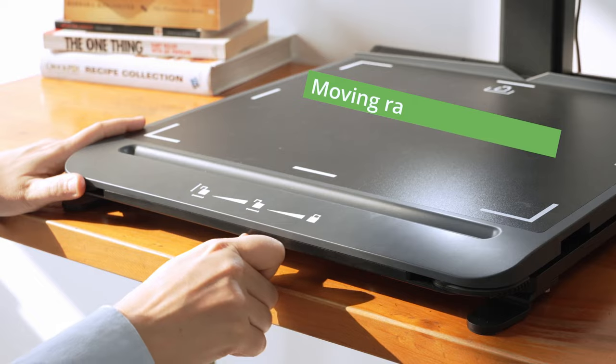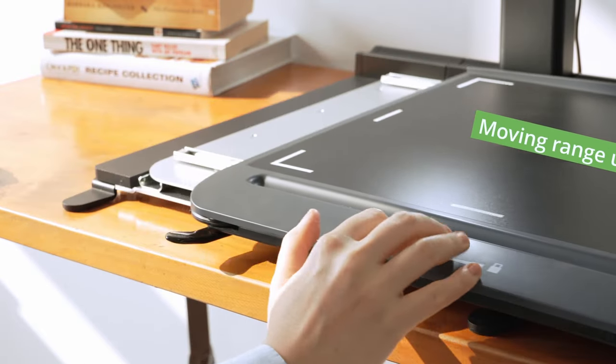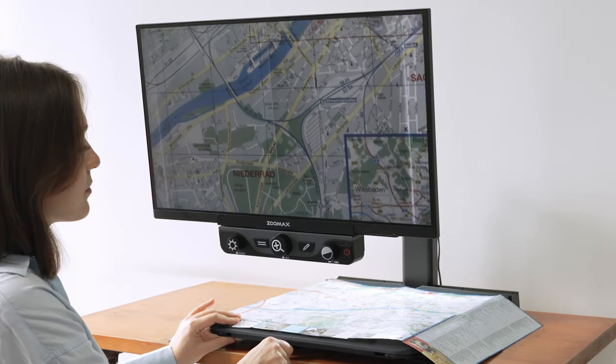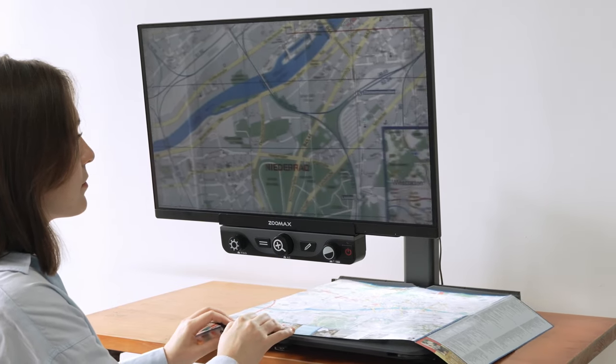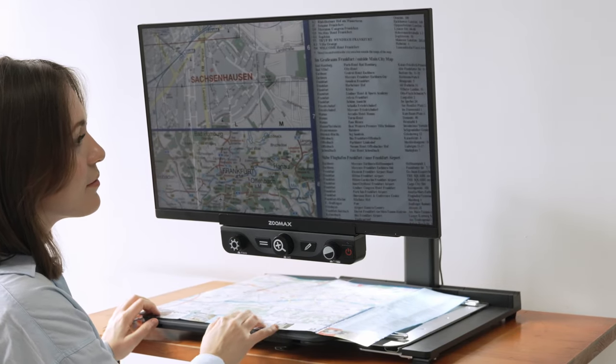Luna HD 24 Pro provides enough space for writing letters, doing homework, or engaging in a hobby like crafting and so on. You can easily control the movement using the XY Table Handle. The medium resistance of the XY Table reduces the need to move the XY Table and avoids stuck displays and delays caused by movement.